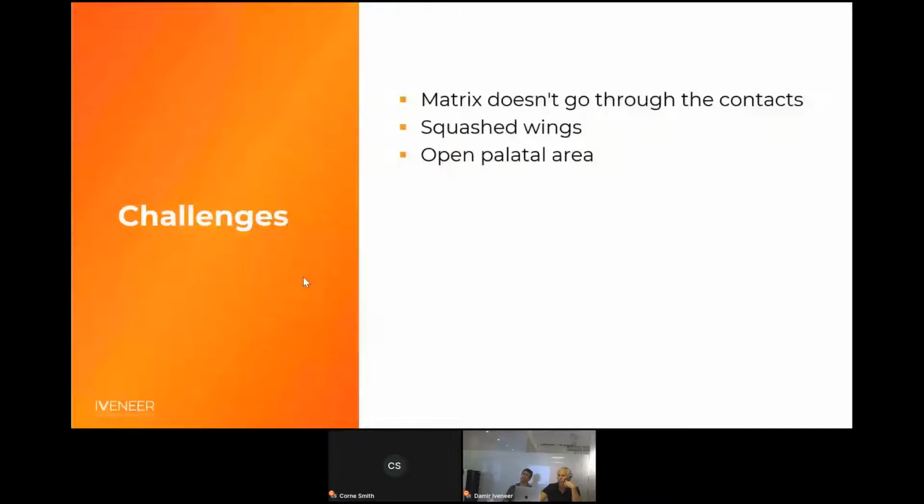Either with a freehand flowable, just putting a very thin layer of flowable from behind and not stuffing it inside, and curing. Another way, you can just draw the missing part on your glove, adhere it to the palatal area and cure it. Or you can draw the missing part on a Miller strip, put it from behind and cure it. Or before you put the matrix, you build the palatal shell freehand, either with your glove or with the Miller strip.